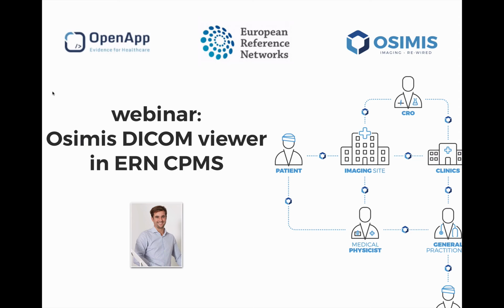My name is Frederick Lambrecht and I'm the co-founder of Osimis, the company that provides the DICOM viewer used in this portal, as well as the support that goes along with it.